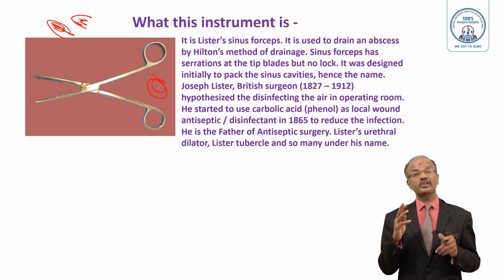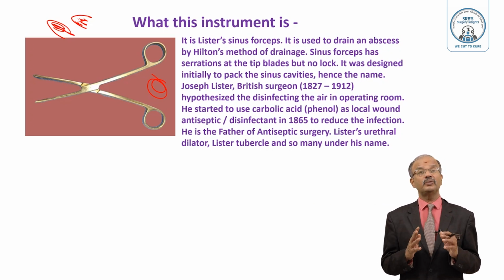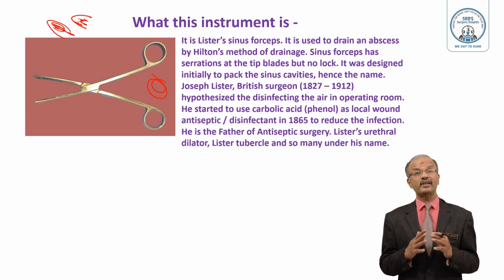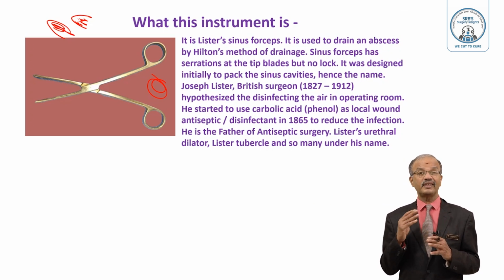Sinus forceps was originally designed to pack the sinus cavity. That's why it has the name. Joseph Lister was the British surgeon who started the use of carbolic acid as an antiseptic solution for wounds, very successfully decreasing the infection rate after surgery.